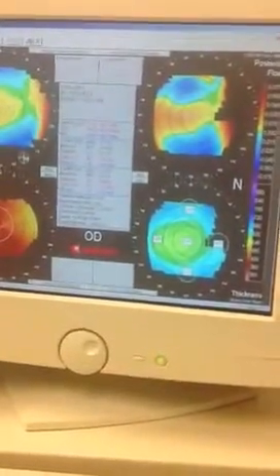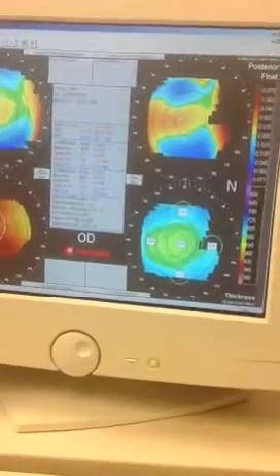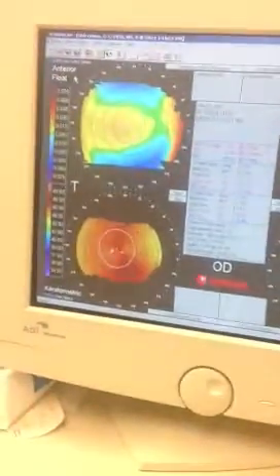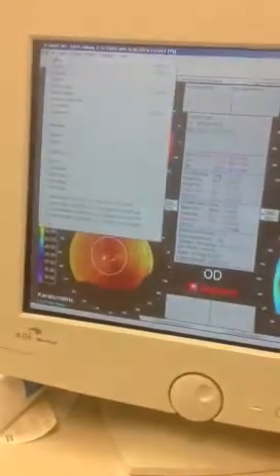And so basically now what you have is a regular topography. Obviously you want to save this, so you're just going to go in and File, Save Exam, and you can close the exam, and then you can go back and look in your files, and you'll see where it was printed there, or you can go into your database, edit your database, and you'll also see where I've got it down here, and you can bring it back up.